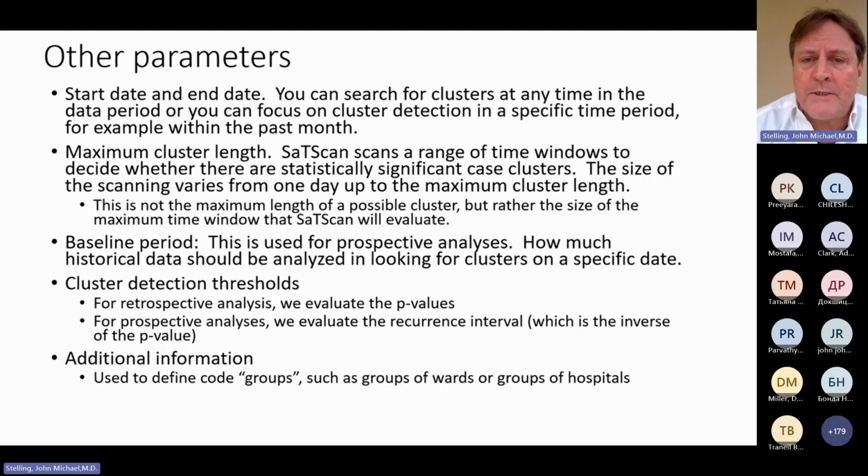So if you're looking for outbreaks of Ebola, 1 or 2 weeks of data is enough. You look at the incubation period. If you're looking for an outbreak of salmonellosis, 30 days is generally enough. If you're looking for an outbreak of Klebsiella pneumonia, 60 days is usually enough. I said usually enough, and I think that's true. However, we did miss some of our important outbreaks when we limited to 60 days, which is why we now go up to 180 days.